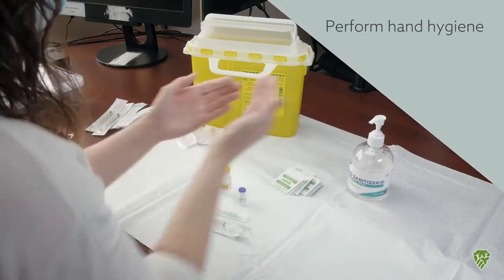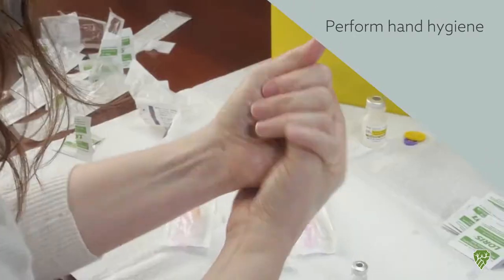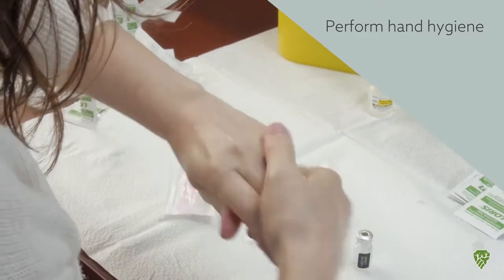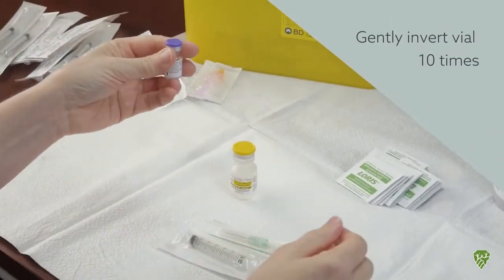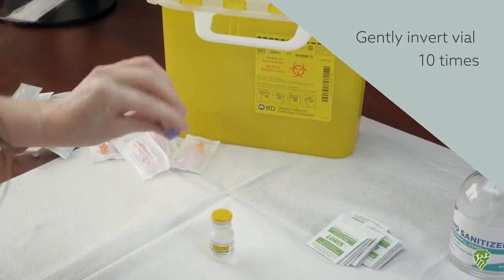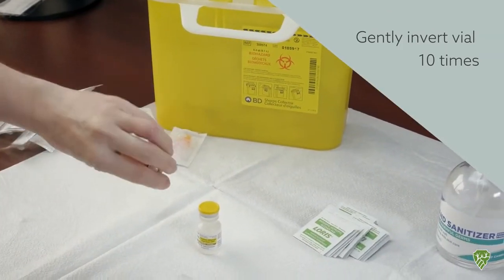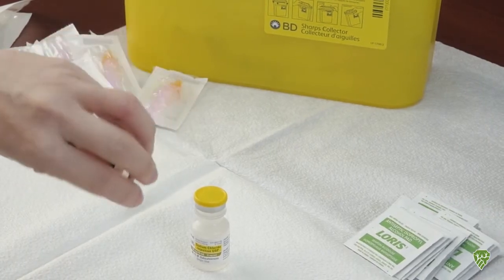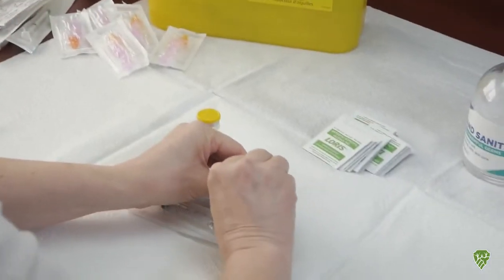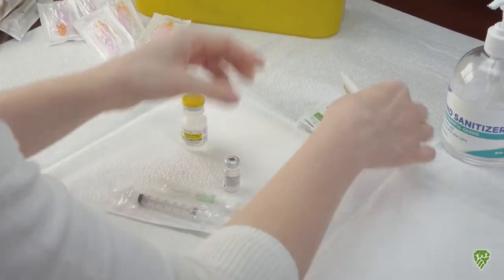Okay, so I'm just going to start off with doing hand hygiene. Then with the vial of vaccine, the first thing to do is invert it 10 times gently. And then I'll be wiping the top off with an alcohol swab.